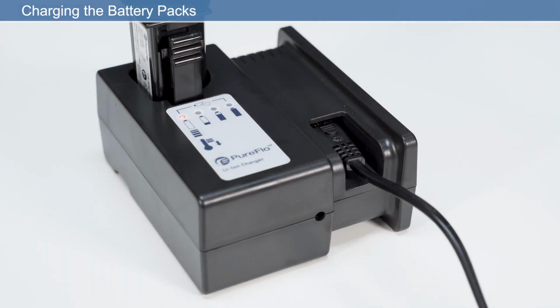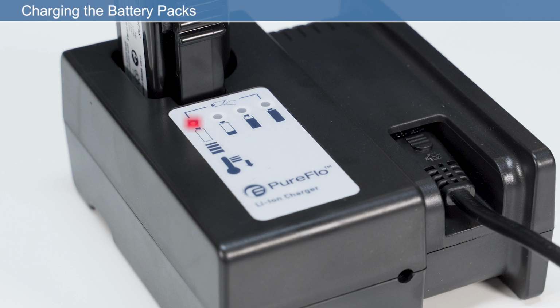There are 4 LED battery indicators. LED 1 flashing red indicates the temperature is too low or too high for charging, or that the battery has failed. When LED 1 is solid red, the battery is charging. As the battery charges, LED 2, 3, and 4 will light sequentially solid green until fully charged. If LED 1 flashes red and LED 4 flashes green at the same time, the battery has failed.